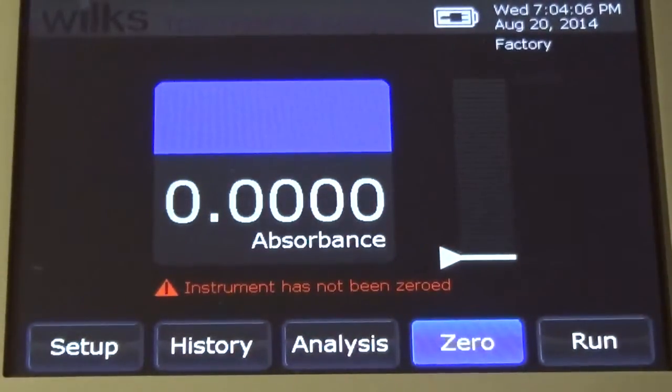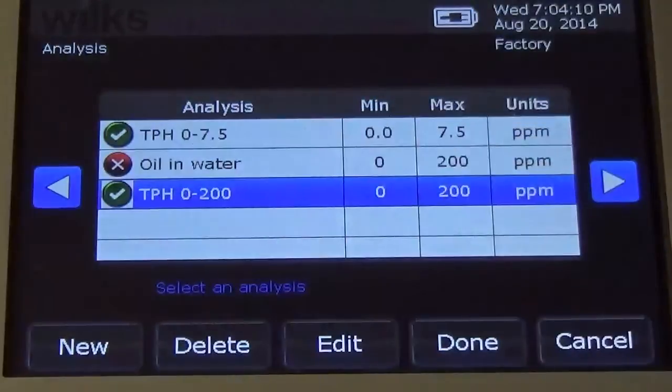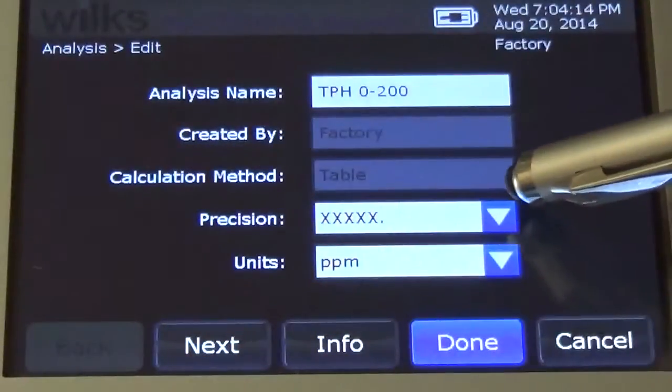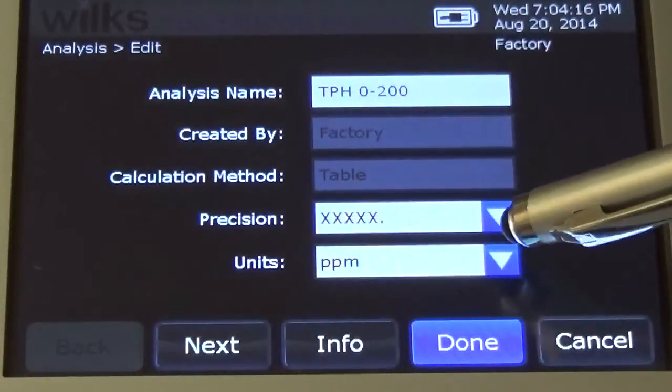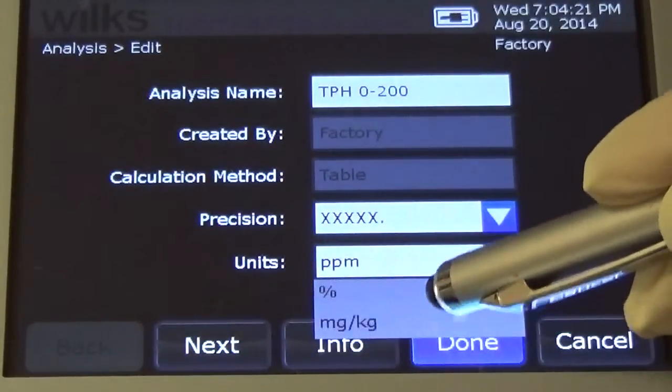Select Analysis and then highlight the appropriate factory calibration from the table. Select Edit. The precision should have no decimal points. Select the appropriate units, typically ppm or milligrams per liter.